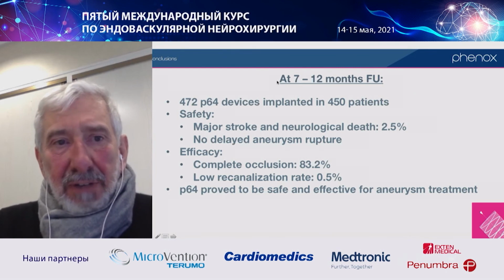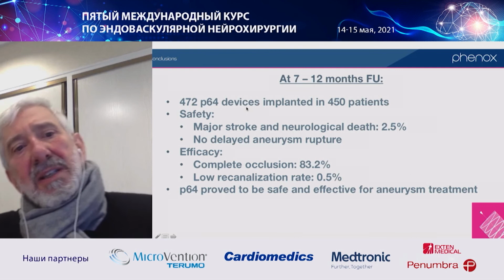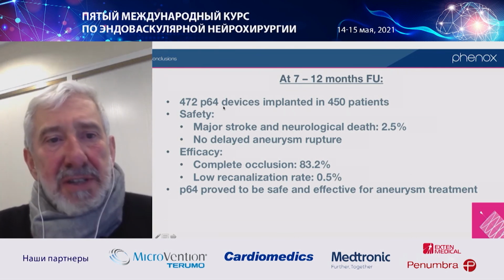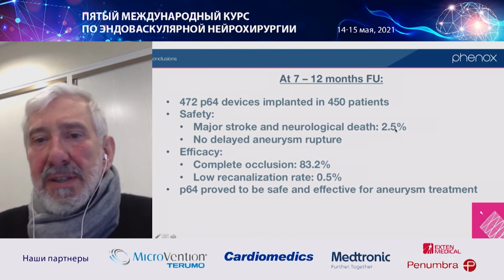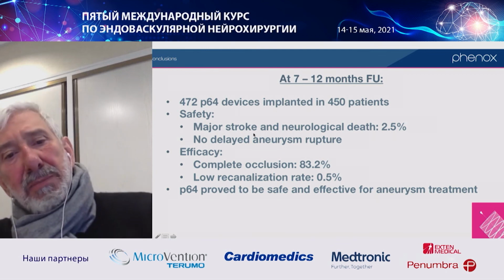At 12 months, you see that 472 P64 devices were implanted in 450 patients. On safety, you see that major stroke and neurological death was observed in 2.5%. There was no delayed aneurysm rupture.